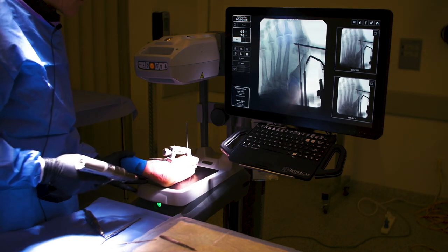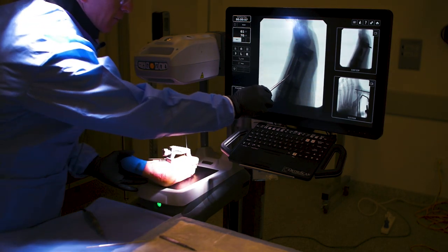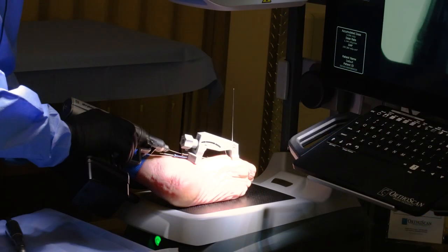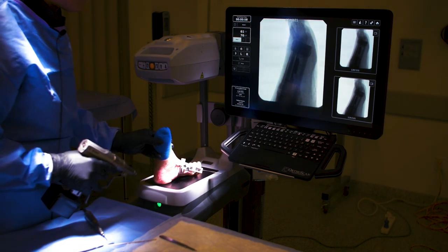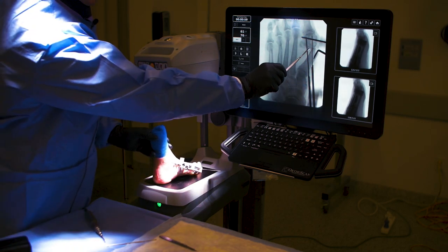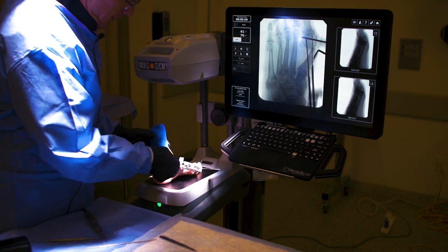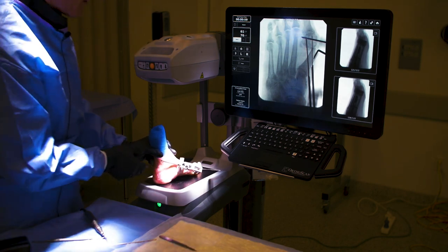I get another good lateral: I'm right in line, it's a good profile, my wire is going nice and in line with my first wire. I advance a little more — probably right to the articular margin. I'm happy with that; this is really where I like it to exit — in the gap between cortex and head, finding a nice space right there. I have great spread and I know they're centered. The next step is to drill and place our screws, take depth measurements, and all the good stuff. We take the first big sleeve off, go right down to bone.